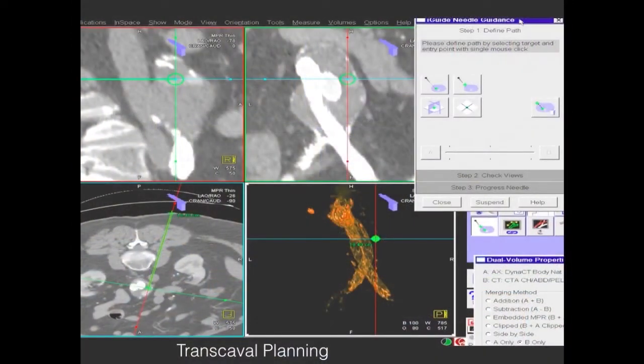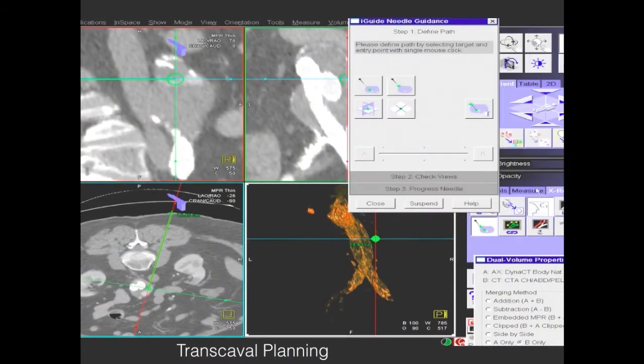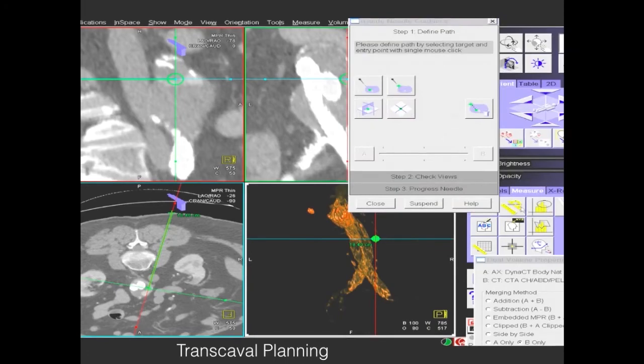Here's another example where we're using transcaval access to an anteriorly placed endoleak. This approach also helps you avoid the stent graft itself.